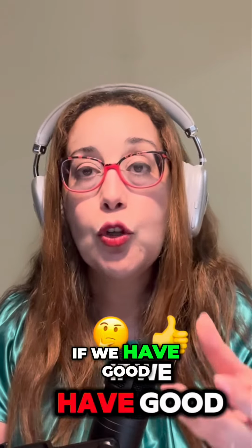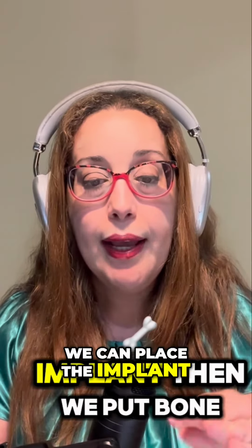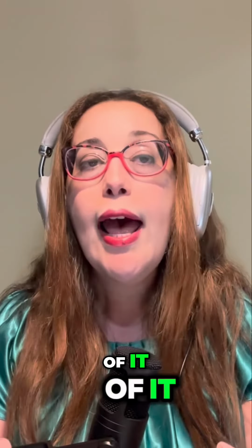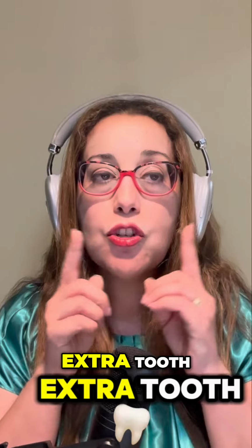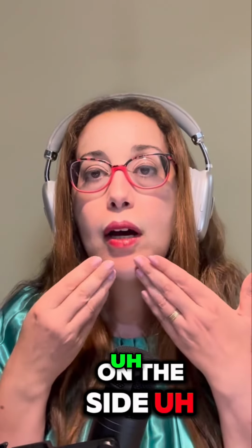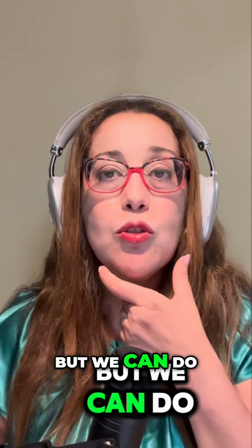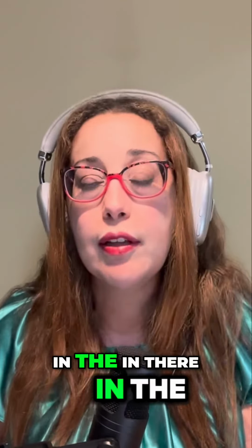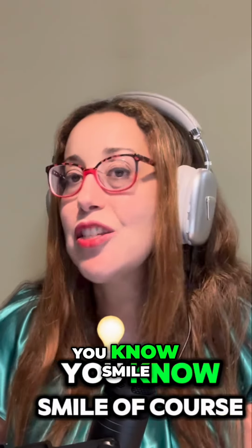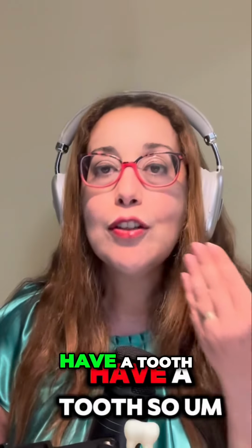if we have good bone surrounding it, we can pull the root, we can place the implant, then we put bone around it, then we put a little membrane on top of it, and then usually I would put an extra tooth, like a fake tooth, kind of attach it to the two teeth on the side, or we can make like a little, I wouldn't use a flipper, but we can do like an Essex retainer with a little tooth in there. And then the patient leaves with teeth, a smile. Of course, you're not gonna bite on this until we are completely finished, but at least you have a tooth.